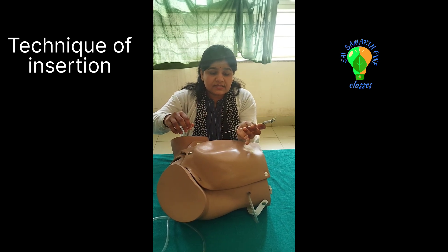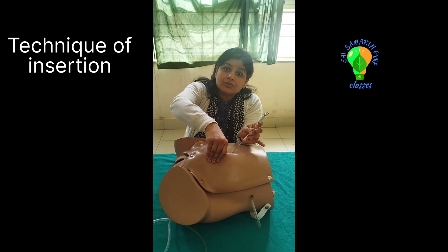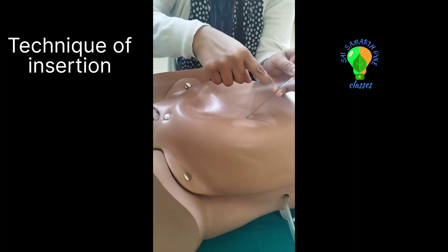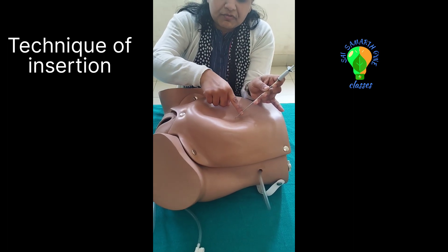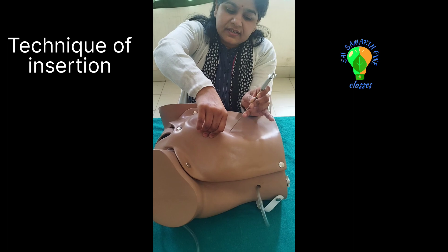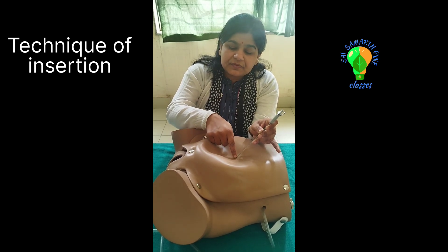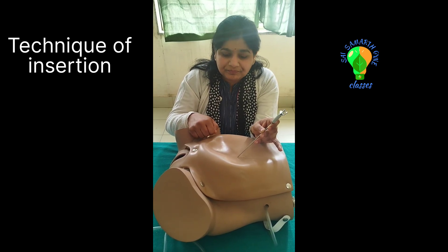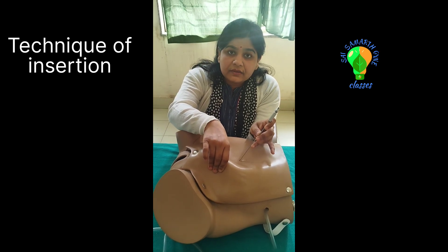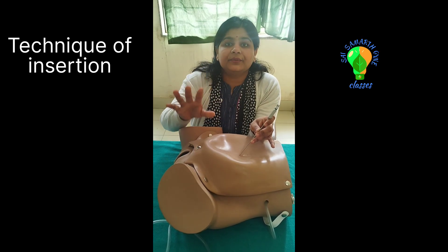Now take your Veress Needle, hold it in guard fashion, and make entry through the incision site. The angle of the Veress Needle with the body of the patient should be 45 degrees. The angle with the skin fold that you have elevated should be 90 degrees. The tip of the needle should be directed towards the anus. Insert the needle carefully and you will feel two click sounds — one when it enters through the rectus sheath, and the second when it enters through the peritoneum.